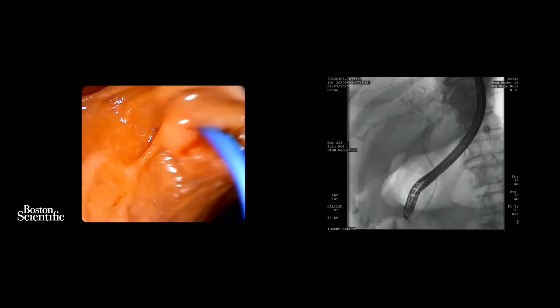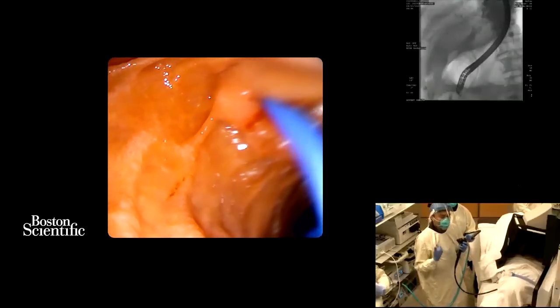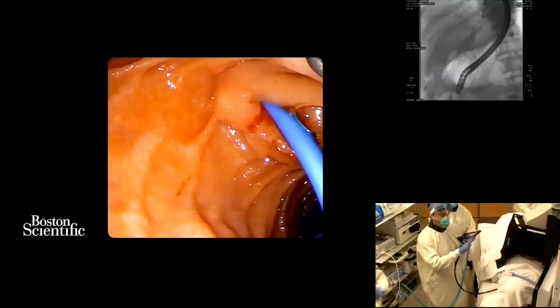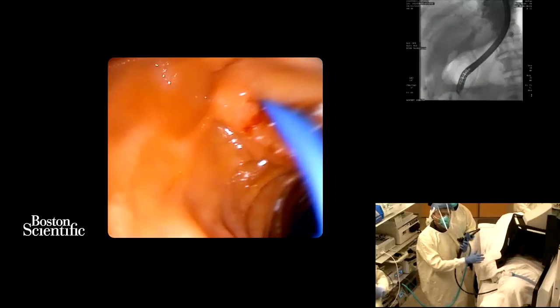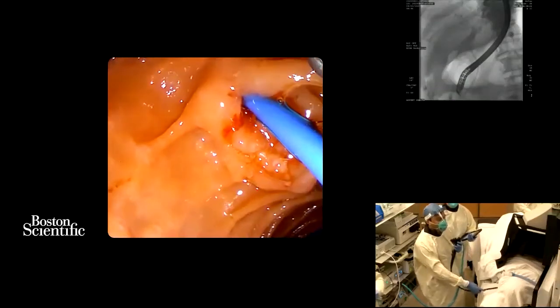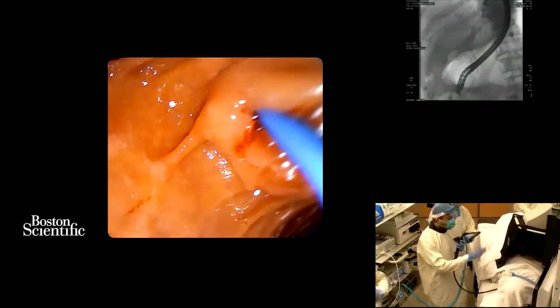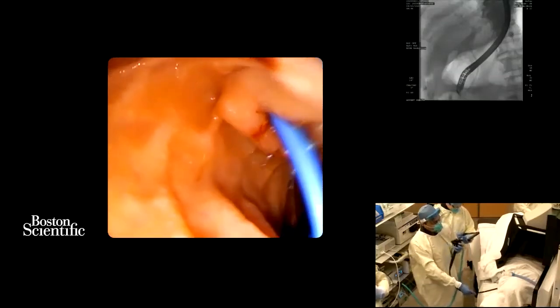And the company is also working on 3D mapping. So if you've got images on a 3D, on a hilar cholangio and so on, they are trying to see if they can program something and integrate it per case basis in the fluoroscopy machine so that it will provide us a detailed anatomy of the liver, hilum, and so forth. But to my knowledge, this AI system now exists only in one technology, which is Omega imaging. So this procedure is now complete.